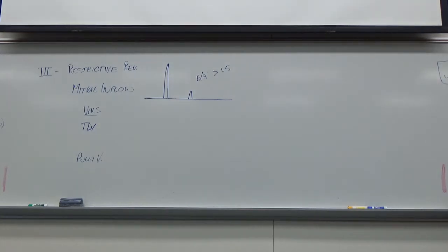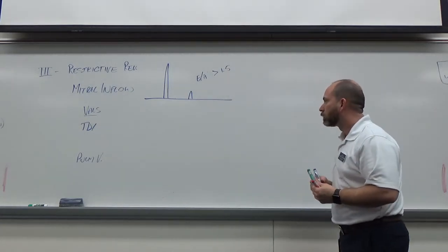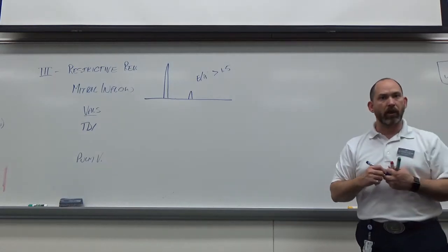So taller and a very quick deceleration time. Now we're getting into less than 150 on your deceleration time. Normal is 150 to 240. For impaired relaxation, the decel time is greater than or equal to 240. Pseudo-normal does come down, it goes 150 to 200, and now we're less than 150. So it's a very, very steep drop. That should be the main thing.